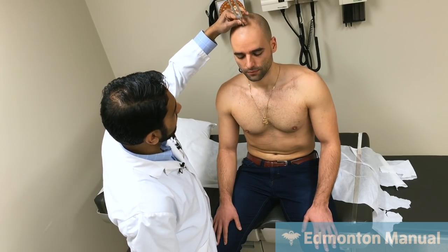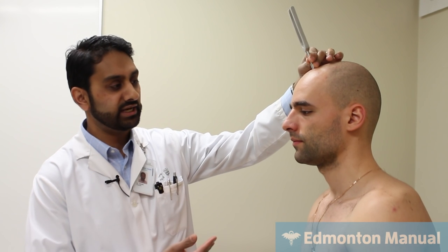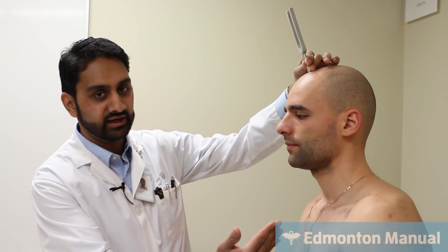And I'm gonna ask the patient which side he hears it. Okay, now he's a normal patient, so he actually hears in the midline, but let's pretend he says, "Hey doc, I actually hear it on my left side." And it makes you think, well, that's odd. He said he has left ear problems.